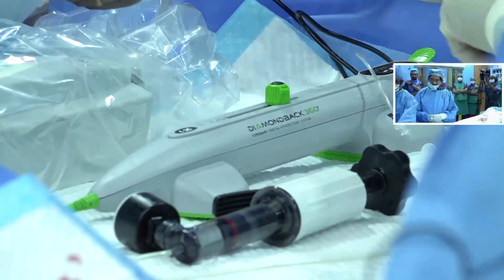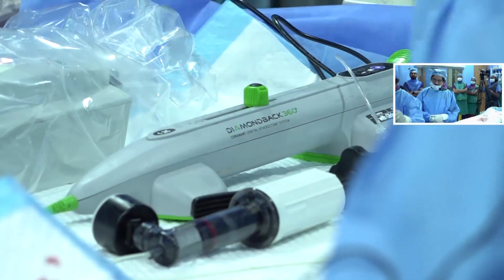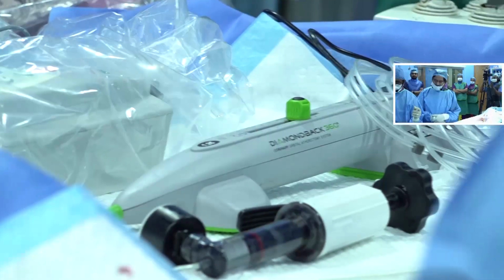So here, this is actually the device. What about the saline? Is it ready?